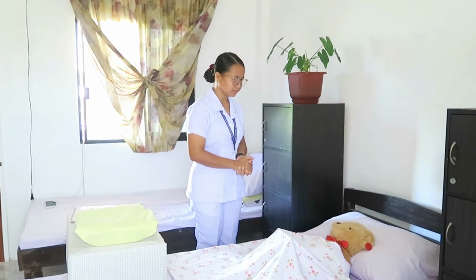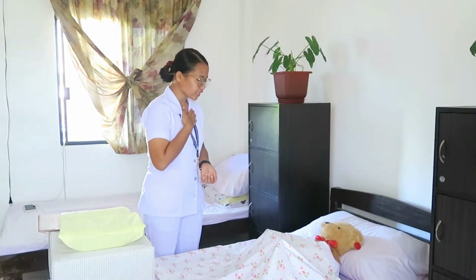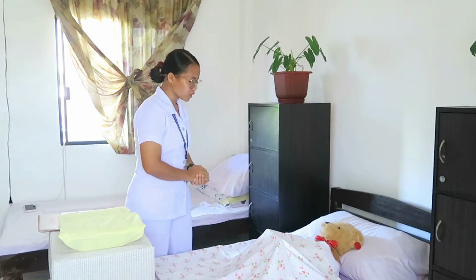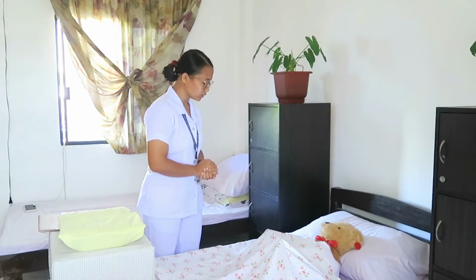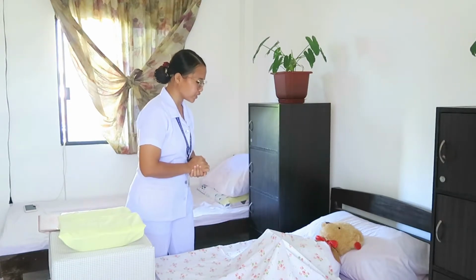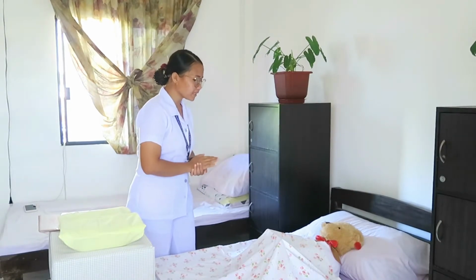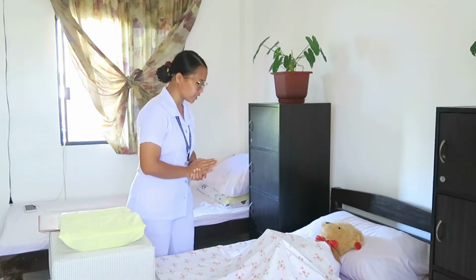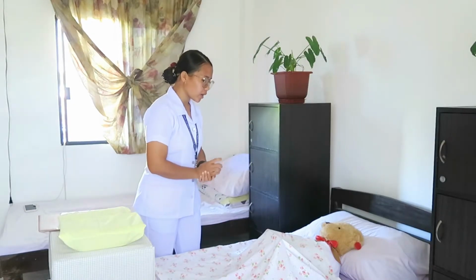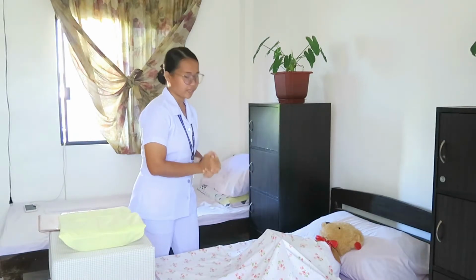Start mo, Jo. Good morning, ma'am. I am Maple K, a student nurse. You can call me Maple. May I know what is your name and birthday po? Okay, ma'am. So, ma'am, what do you want me to call you? Okay, ma'am L. So, ma'am L, this procedure that we are going to do is inserting a Foley catheter. I will expose your perineal area, but let's assure that I only expose the part that is needed to be exposed and no other people are allowed inside unless you request to have your partner or one of your family members. Is that okay, ma'am? Okay.